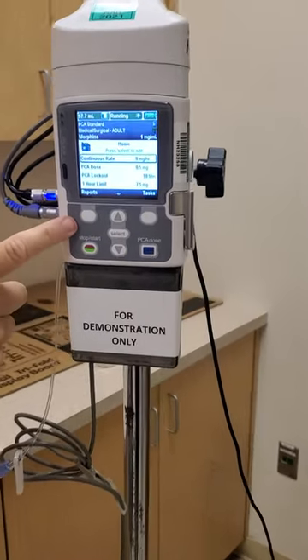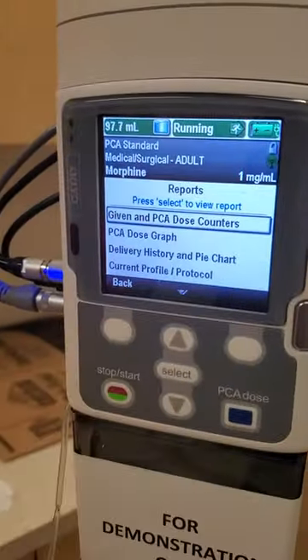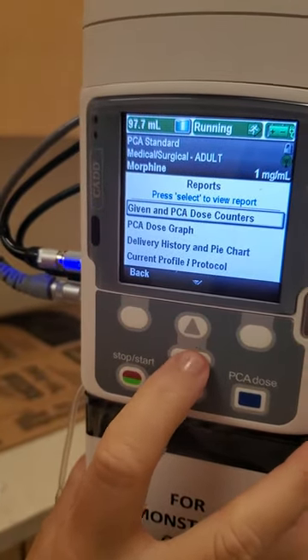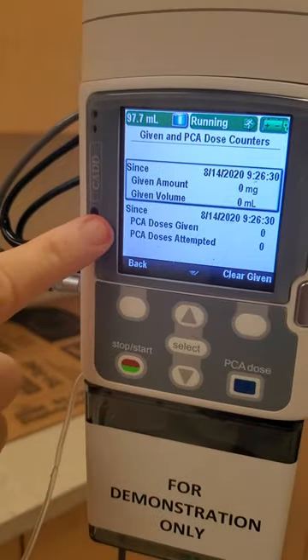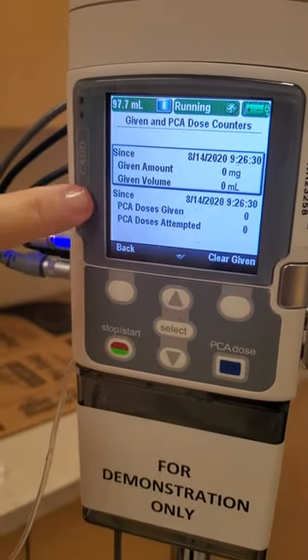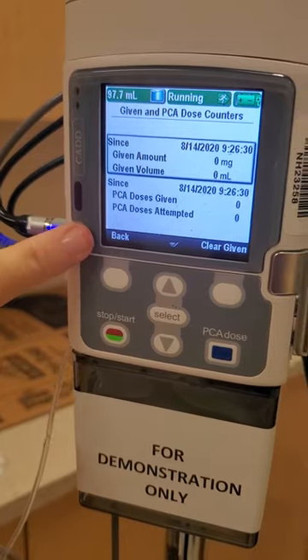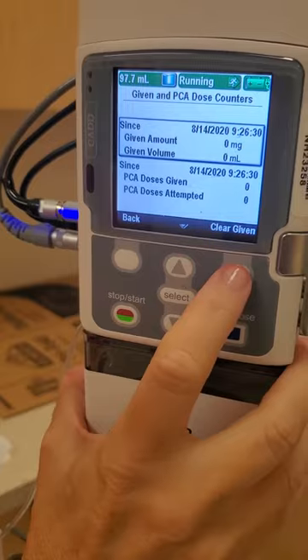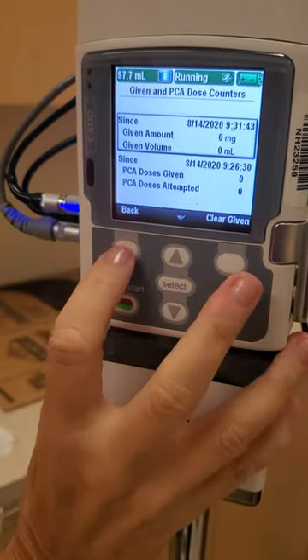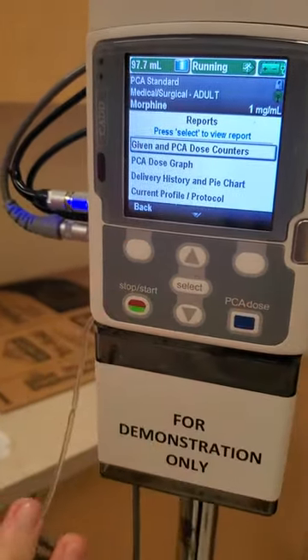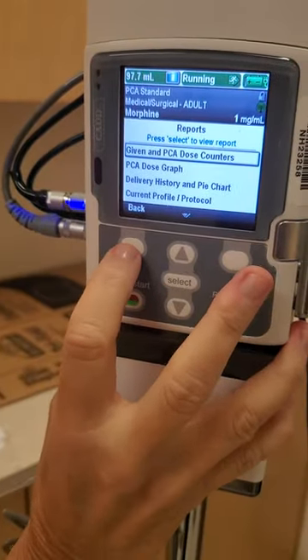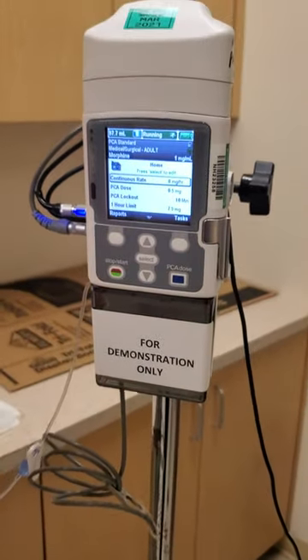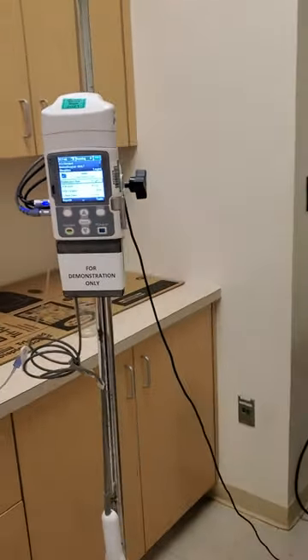One last thing I want to show is the reports, because you're going to need to document approximately every four hours on what has been attempted and what has actually been given. Here I just started it so there are no numbers yet, but I would review that every four hours, document it in my charting, and then clear it. And that's pretty much how to start a PCA pump. Thank you.